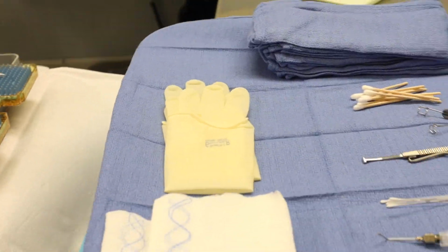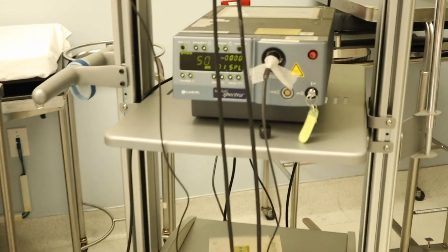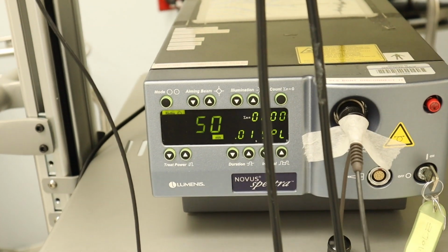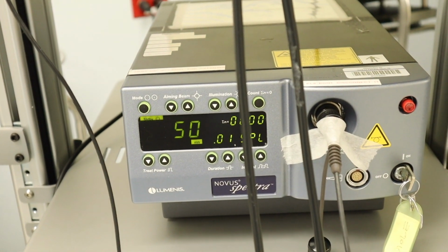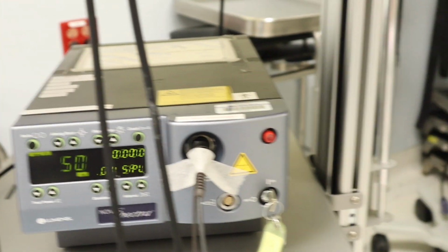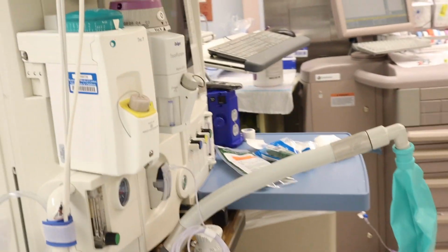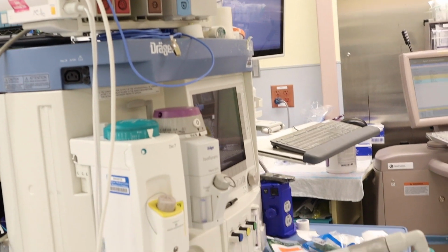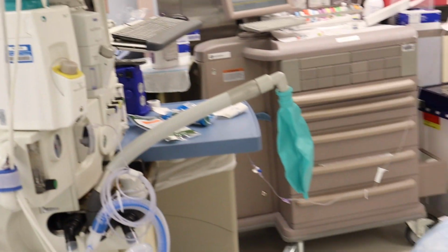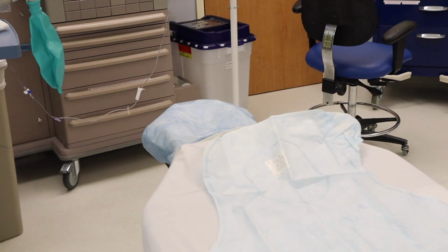So now we're just making sure, yep, laser turned on. I'm going to adjust all my settings. These are not my settings right now, but you want to make sure everything turns on before you bring the baby back and put the baby to sleep. Anesthesia cart, all their stuff. They're the heroes. I mean, they do all the really hard work of keeping the baby alive so I can concentrate on the eyes.